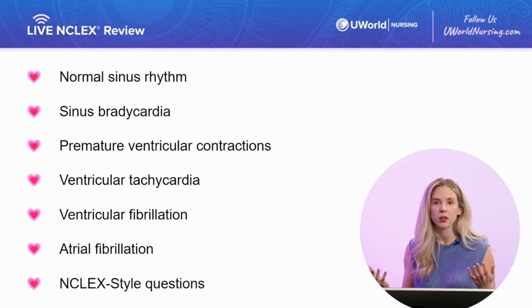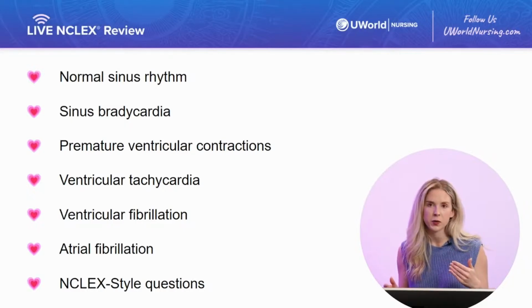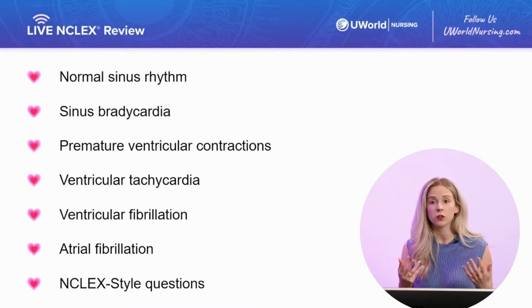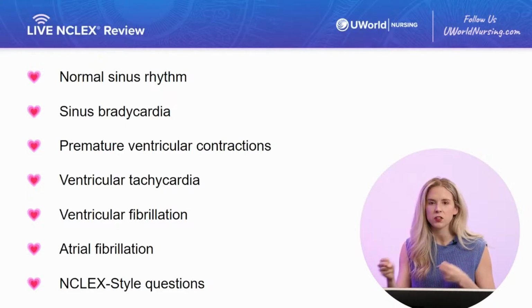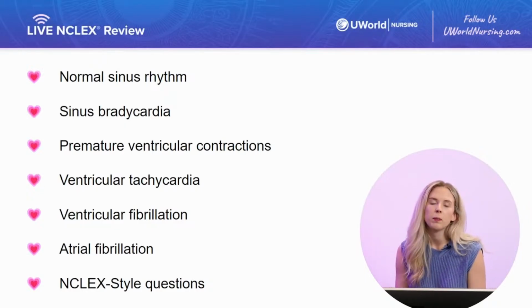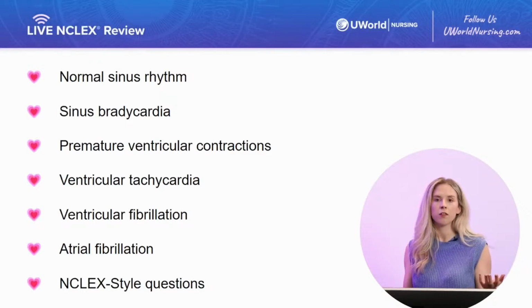And again, we have a left and a right ventricle. Remember that our ventricles are bigger than our atria. So the visual representation of the electrical activity of the ventricles is going to be bigger. It's that electrical force to squeeze the ventricles. It's going to take more than it does for the atrium. The T wave represents the repolarization of the ventricles, or the relaxing of the ventricles.